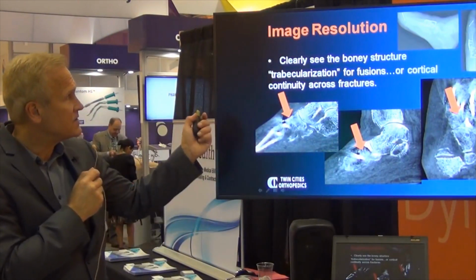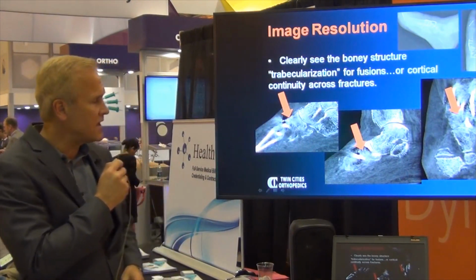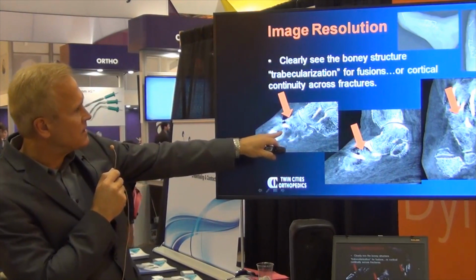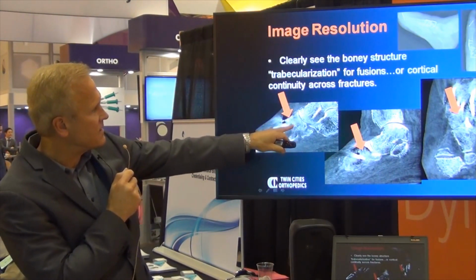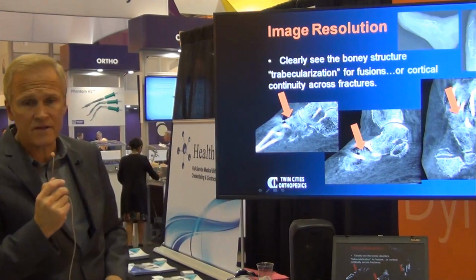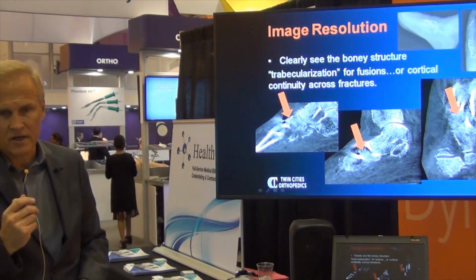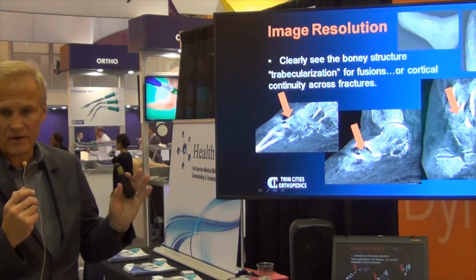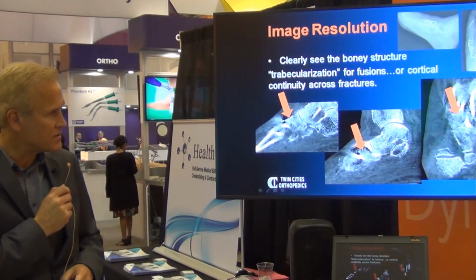So here's one of my cases. It demonstrates some of the resolution that I get from my little CT scanner in my office. And here's a TMT fusion. This is second TMT and third TMT fusions. You can see the trabecularization across those fusion sites. That's what I want to see when I tell the patient to start full weight bearing or increase their activity or go back to work, so that I'm pretty confident that 50% or more of that fusion is already trabecularized and fairly solid.